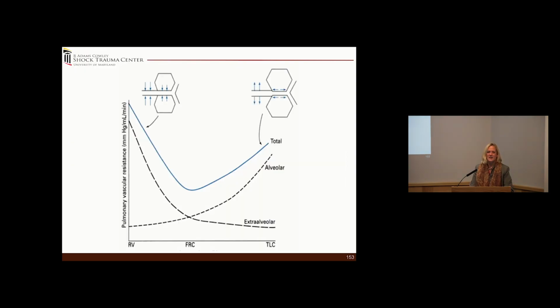But why does that not increase right heart strain? Well, as we know, at residual lung volume and TLC, you are at your highest pulmonary vascular resistance, but at FRC, you are at your lowest. So we took her from residual lung volume to FRC. Of course, if we put anybody in here on an airway pressure of even 20, right, you're going to be at TLC. But she was at residual lung volume.